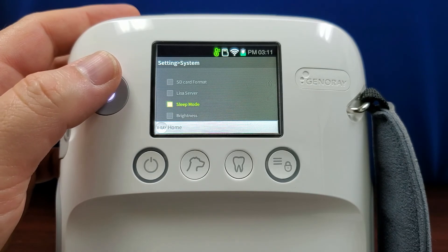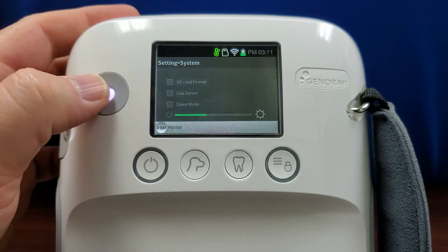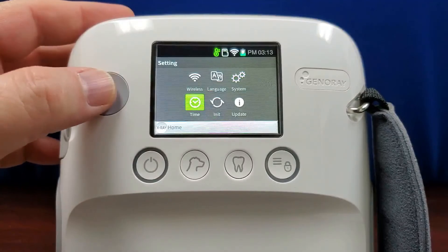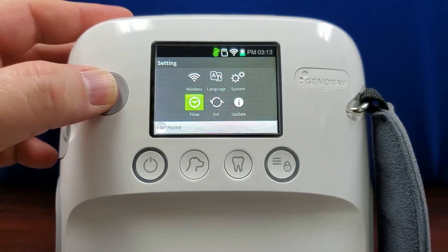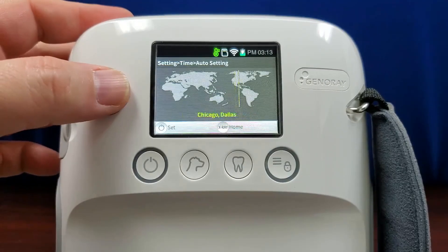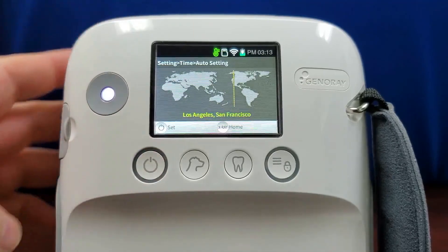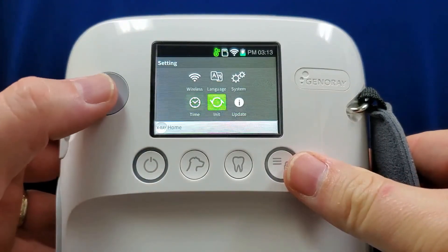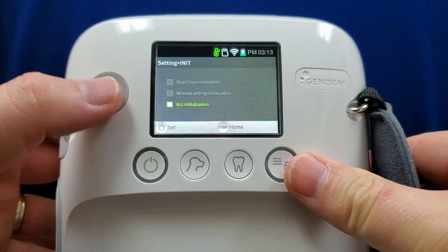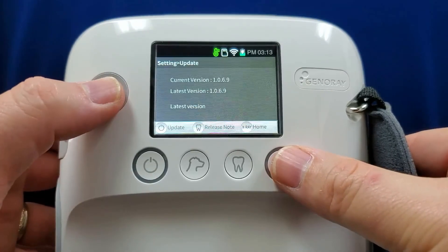Brightness, the last setting in system, can be adjusted by sliding the trackball left or right. Back to the main settings menu, the time setting allows you to manually or automatically set the time on your unit. The automatic setting will ask you to slide the trackball left and right until you select a major city in your time zone. The INIT settings allow you to return the shot time, wireless connection, or all settings back to initial settings. Finally, the update setting will display the current software version.